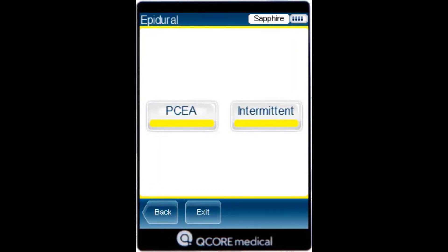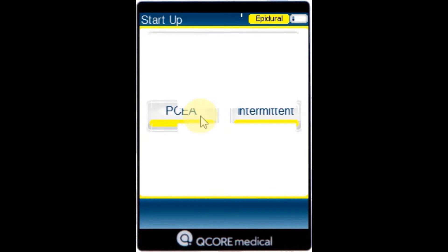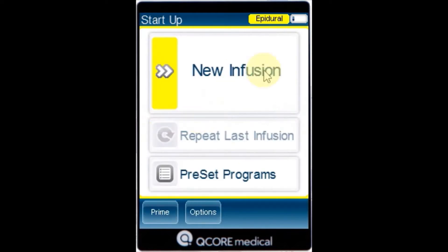To begin a new PCA infusion without a drug library, from the indicator bar verify the pump is in the epidural mode. From the startup screen select new infusion.